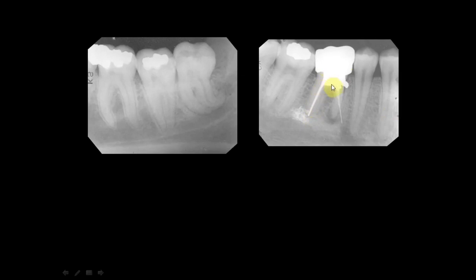And then here you can see that the density is comparatively less when compared to this. You can see certain serrations also in between this. This is nothing other than an endodontic file that has already been perforated through here. So you can see the difference in the density: the radiopacity here is comparatively more than that here.